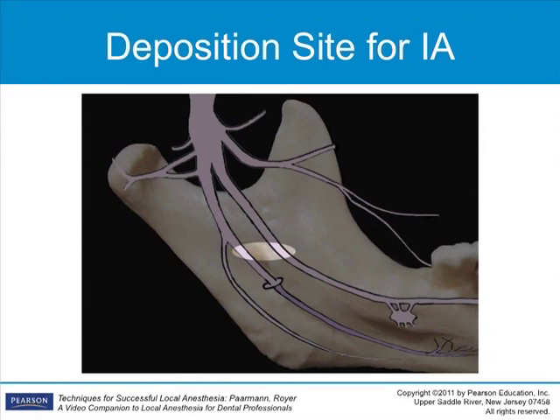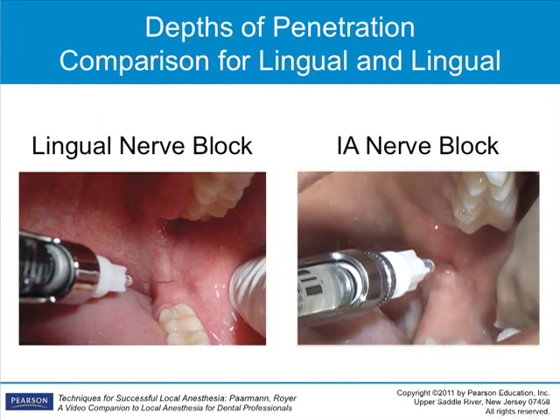Some clinicians give this as a separate injection, which is also acceptable. It may be given on the way in, or on the way out of the tissue, after the inferior alveolar injection has been administered. For this demonstration, the lingual nerve will not be given as a separate injection, but rather anesthetized along the pathway to the inferior alveolar nerve.